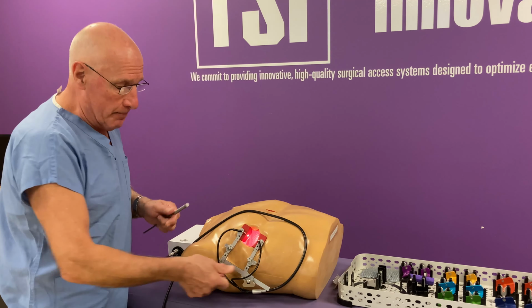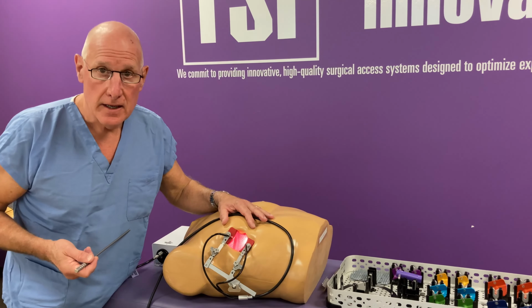So now I'm going to pivot the lower blade. And now you'll see, look at the range of motion I now have with this instrument. So again, I have more access and visualization with less spreading.